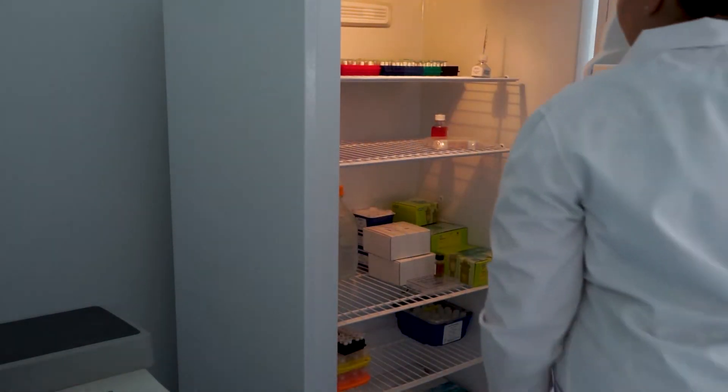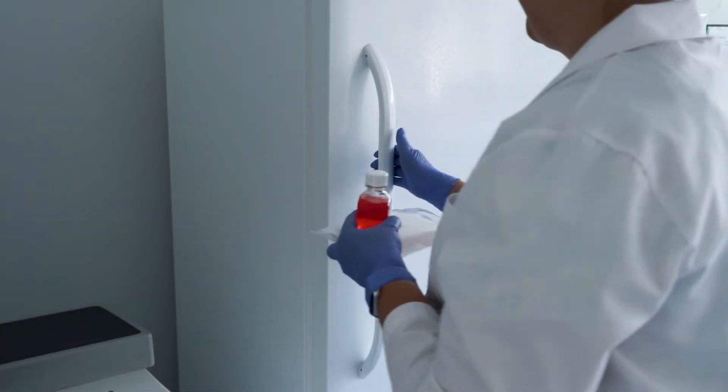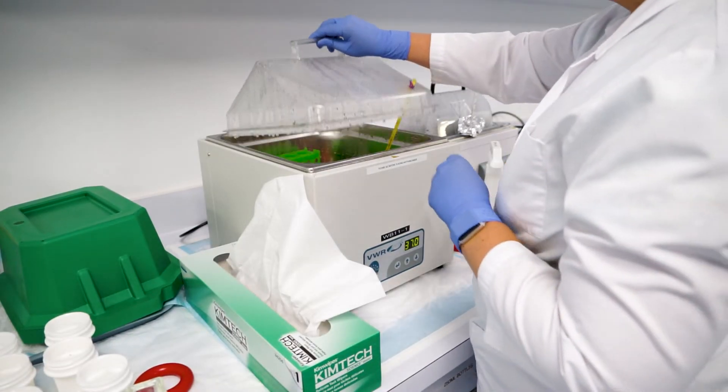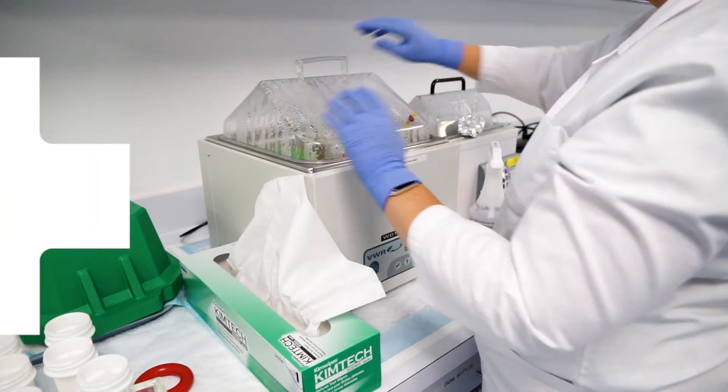Once you are ready to start your experiment, preferably the same day of receipt, tissues should be returned to culture. To do so, first pre-warm the assay medium to 37 degrees in a water bath.